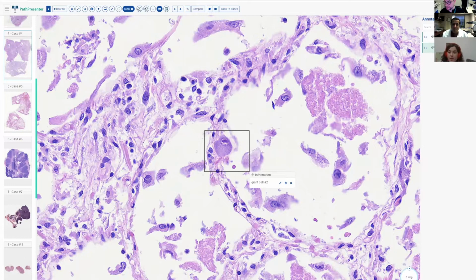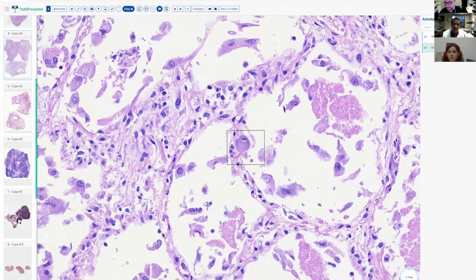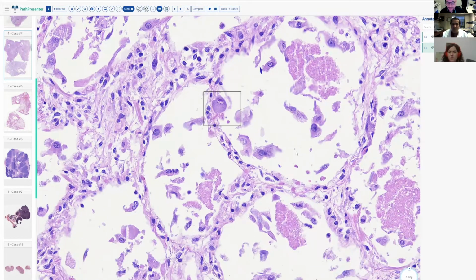And so, is this an AIDS case? I'm not sure of the specific history of it. It's from a teaching collection I have. Yeah, but almost certainly it will be, right? Yeah. There are very, very few other settings in which you get this degree of immunosuppression, right? That you get multiple infections.